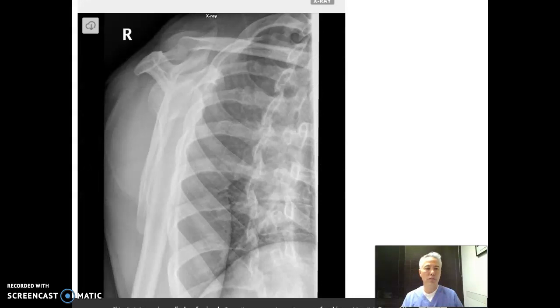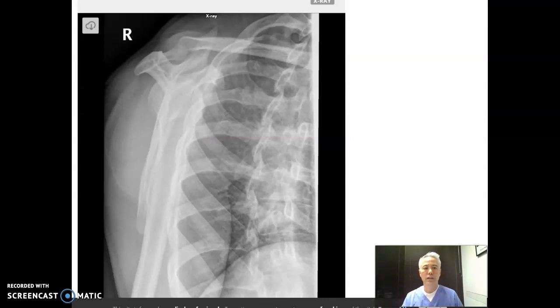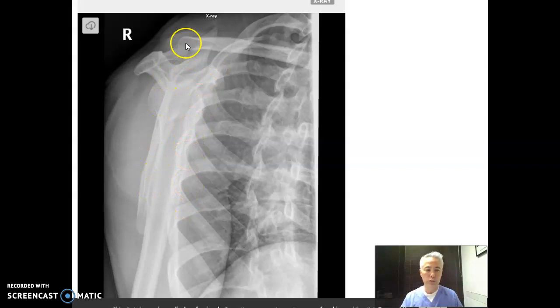The Y view is basically a lateral view of the scapula, but it's an oblique position of the body. The Y that's being formed here — the acromion, this portion here, the coracoid, and then the body of the scapula — forms the long axis part of your Y view. This particular view is not the best; it's not centered properly. It should be centered right over the body of the scapula — there's way too much of the medial portion of the body on here. In terms of positioning it's a pretty decent Y view: the body is away from the thorax, and you've got the clear Y being formed with the head of the humerus basically at the bottom of that Y.